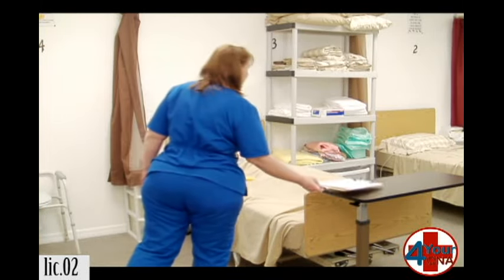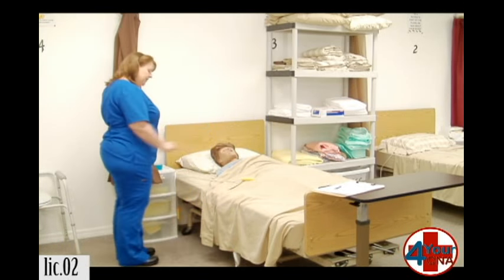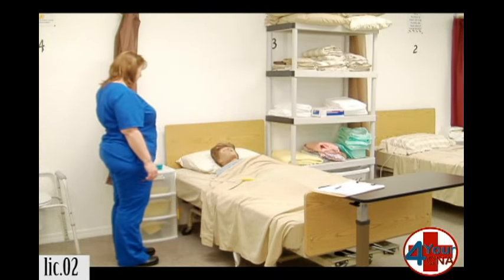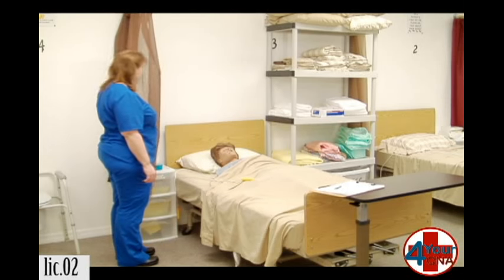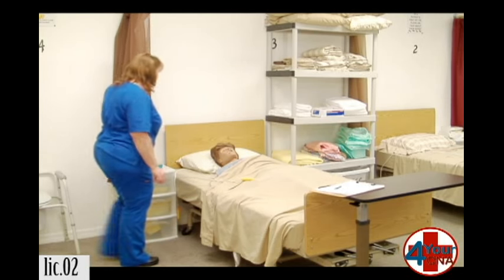Hi, Ms. Jones. My name is Patty. I'm your CNA today. How are you? Wonderful. I need to empty your urinary drainage bag. Is that okay? I'm going to close your curtain, wash my hands, get my supplies, and I'll be right back.